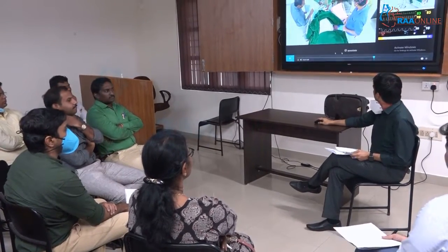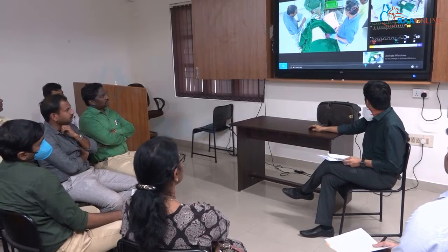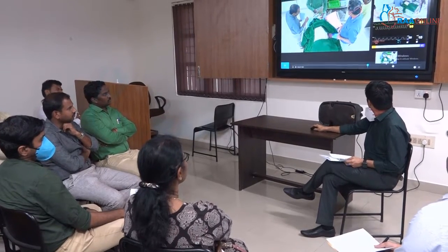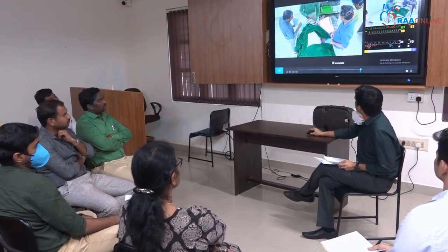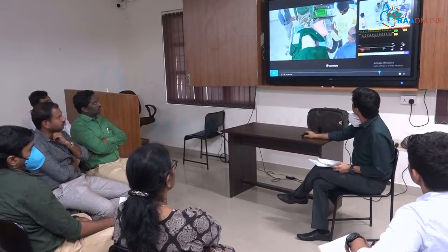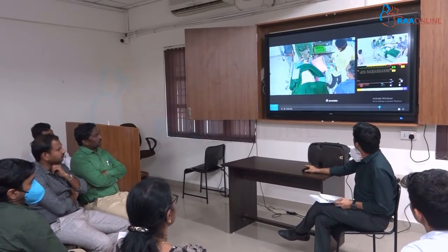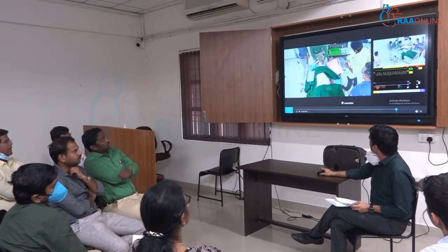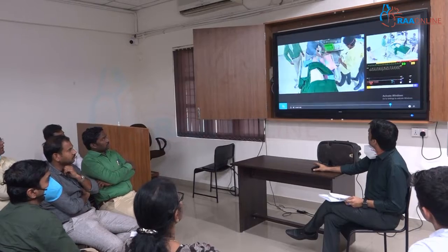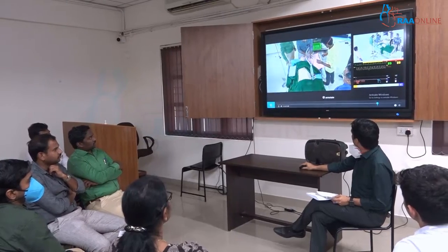Okay, sorry. So in this case, after the second attempt, something has happened. What is the CL grade? Can you say the CL grade? Okay, he is taking over the ventilation. No, he is taking over the laryngoscopy, right? Before that, I think I am not able to retrieve it.